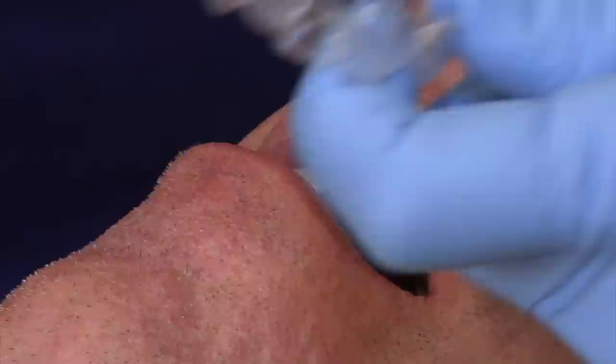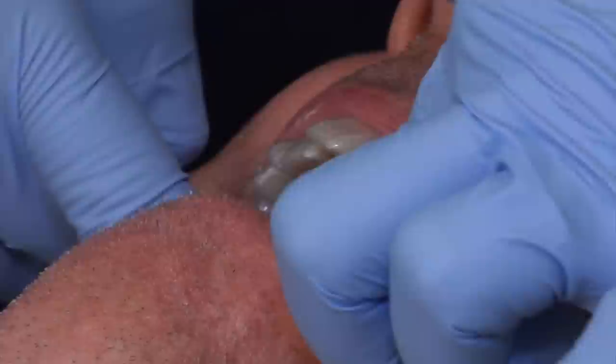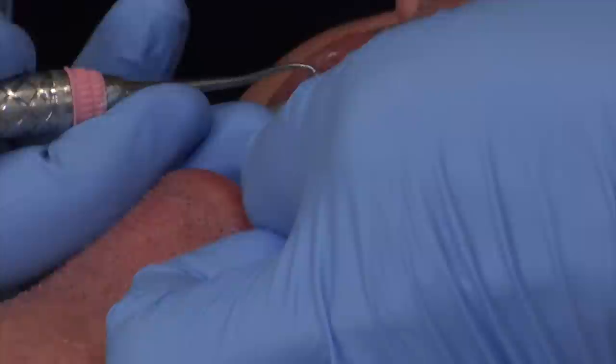Now that the teeth are nice and clean, we're just going to lightly blow some air on the teeth. We're going to insert the tray without any glue inside — we just want to make sure this fits nice. We're going to line it up and press down everywhere on the biting surface of the teeth, really making sure we seat this tray. The tray fits excellent, so we'll remove it.